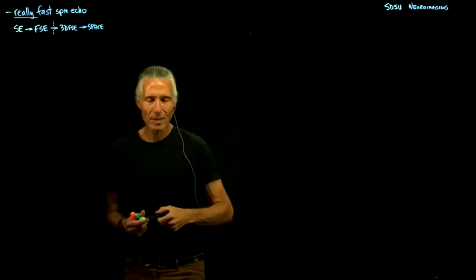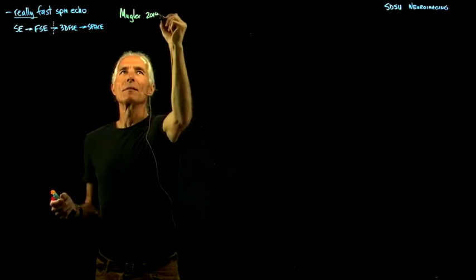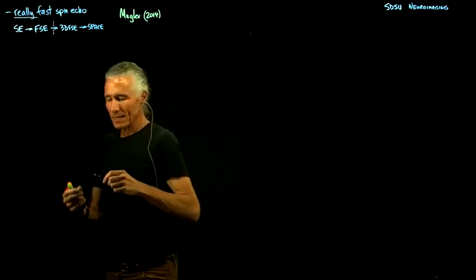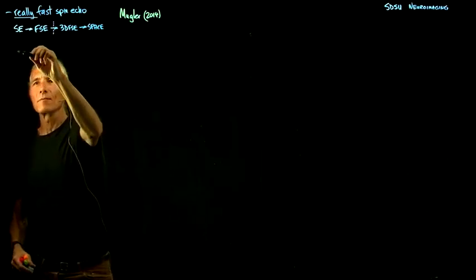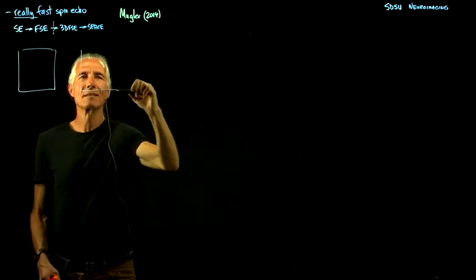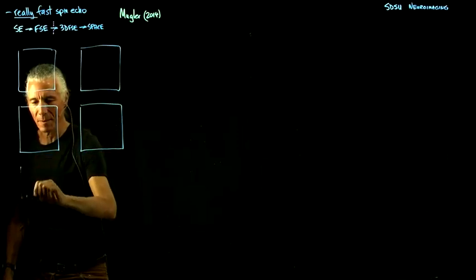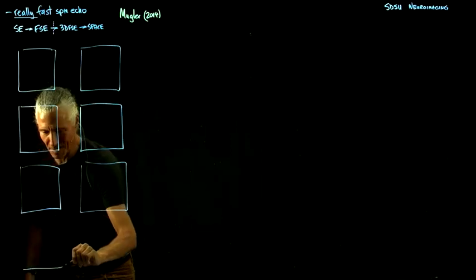And if you want to read about this, there's a reading in the paper by Mugler. You can look at what I'm going to go over here. So let's start off. We'll make 8 of these. What I'm plotting here is time versus flip angle. So we're leading up to the final answer, which is down here.